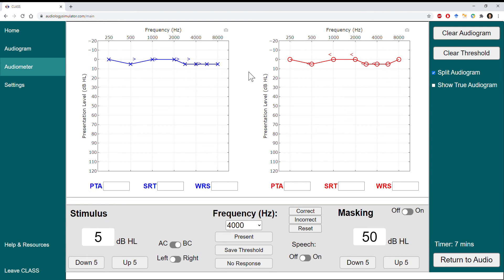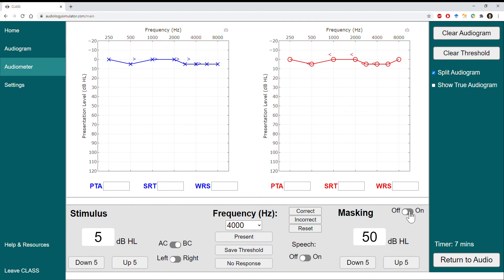Now that I've completed my audiogram, I can do a final check to make sure I've done everything correctly. From this point, you can continue to speech testing, or if this test were more complicated, we may have needed to repeat some thresholds with masking turned on to cover the non-test ear. I hope this brief tutorial on completing a full audiogram using the clinical audiology simulation software is beneficial to you — good luck as you get started testing thresholds.